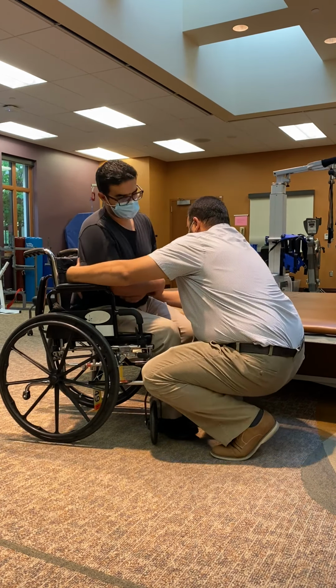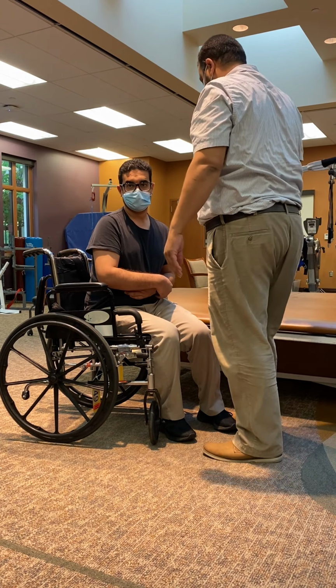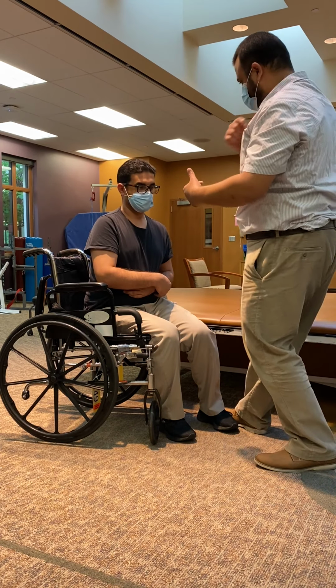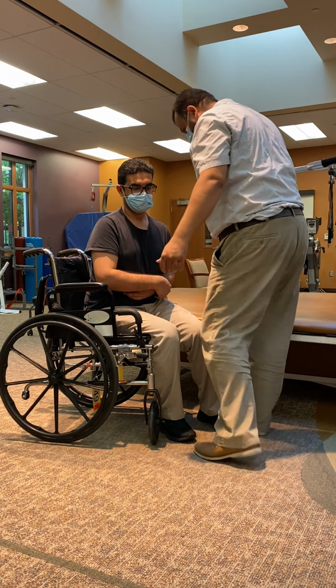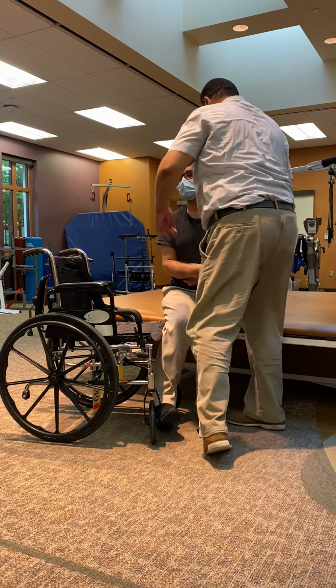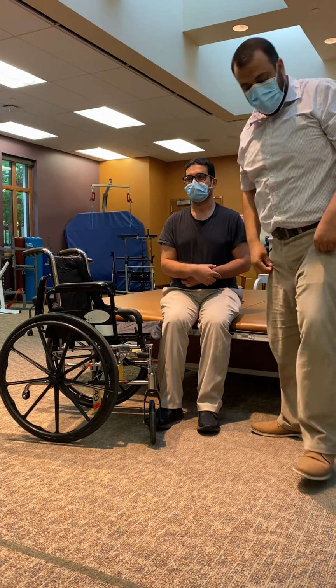Fix your feet, put them back in place. Now I'm going to get you back onto the mattress, okay? When I say 3, you're going to lean over my shoulder and come down together here. I'm going to block your knee with my knee. So 1, 2, and 3. Great job. That was standing.